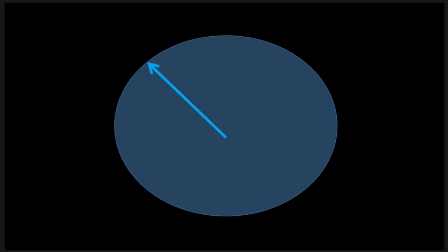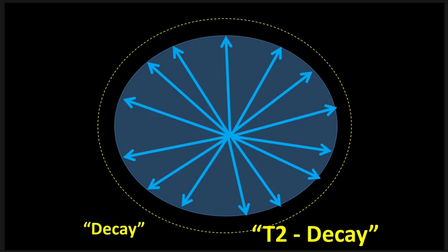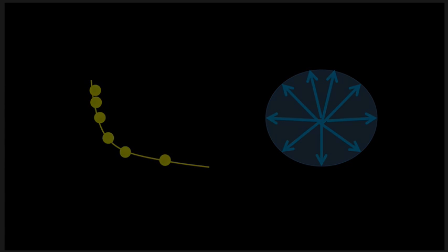So we'll look at it like this, a little bit easier. Then over a certain period of time, they start to get out of order. They dephase back to randomness here. And that's T2 decay. So you often see it diagrammed out like this: more and more out of sync with each other.